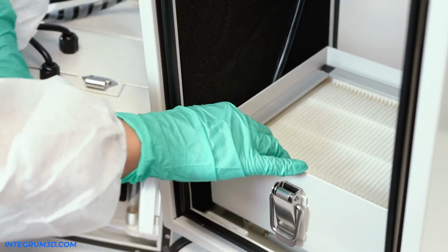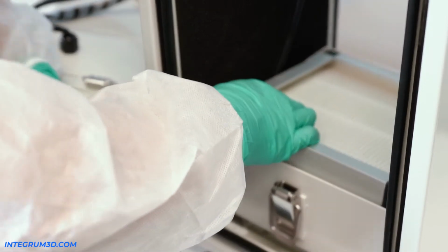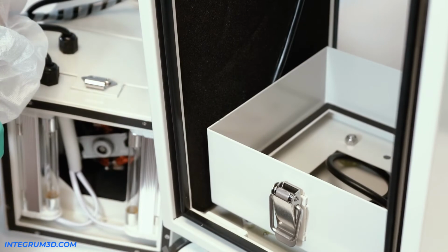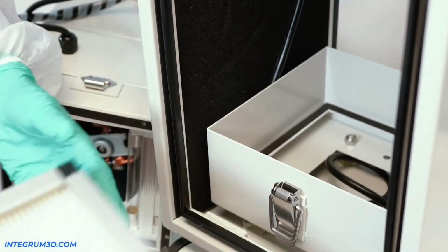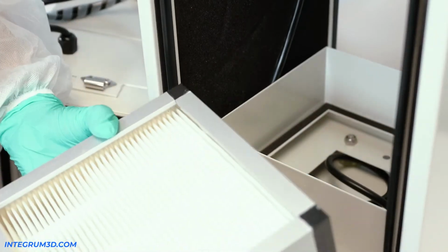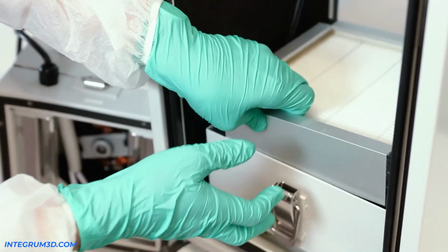To change your H14 filter, you simply lift up on this filter here, pull it out, and switch it out with your new one. When putting in your new one, make sure that this side, the honeycomb side, is facing down, and you put it in the same way you found it.